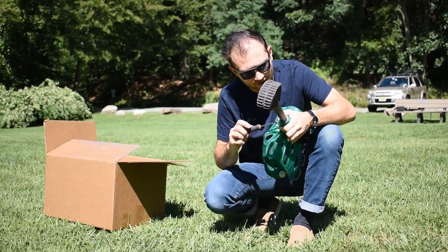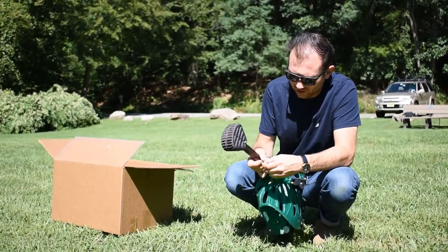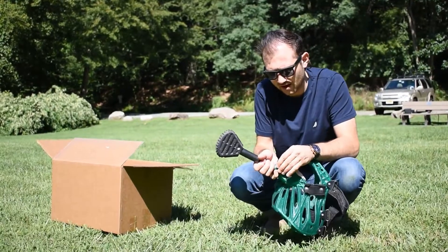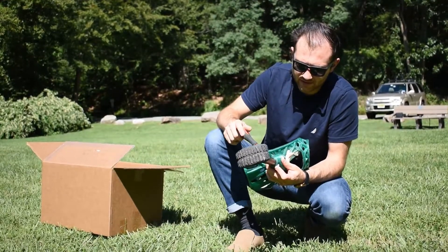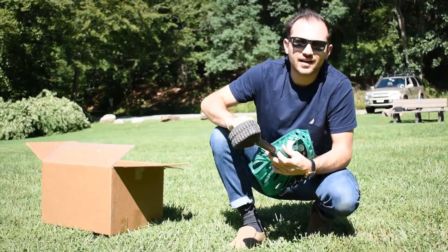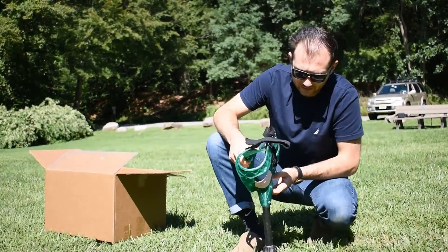We're going to go ahead and put this in. You're going to want to grab a Phillips head screwdriver — you might need to drive this in as we're getting a little bit of resistance. Now that we have that through, we're going to add our washer and the nut. Holding the nut, take your Phillips head screwdriver on the opposite side and tighten this down, making it snug. The washer has grip on it, so you don't need to go crazy with it.